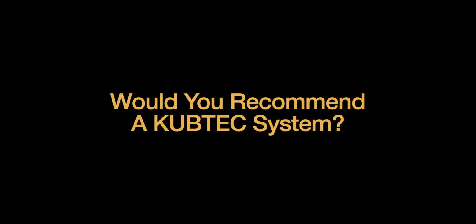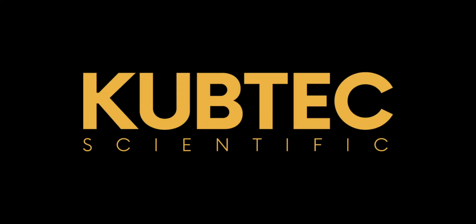As a junior investigator and the manager of our imaging core, I've found the Kubtec system to be quite simple to use, rapid, reliable, and the customer service and technical support to be phenomenal. Any of the challenges that we've had with this instrument have been immediately addressed, and it's constantly used by a number of research groups here at Rush to complement their research activities. We have a number of pending grants under review that are utilizing this system, and we anticipate continuing to do so based entirely on the functionality and the reliability of this instrument.